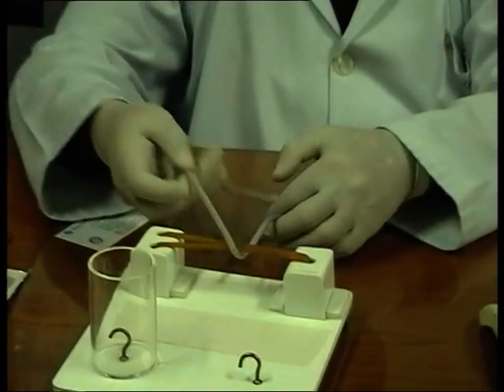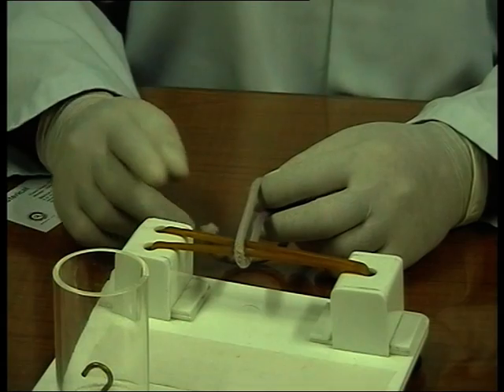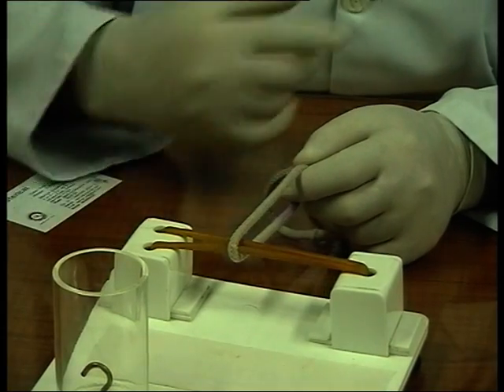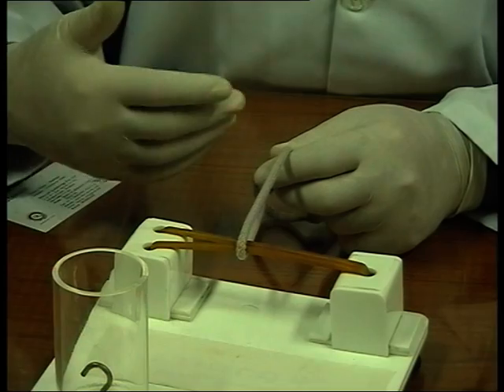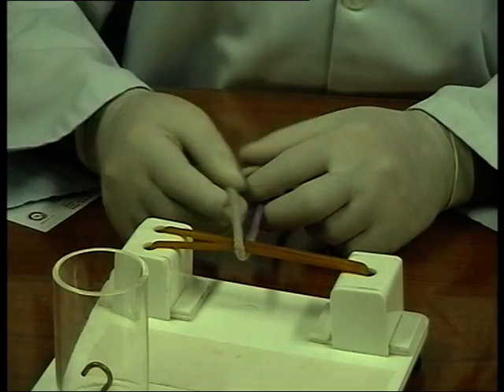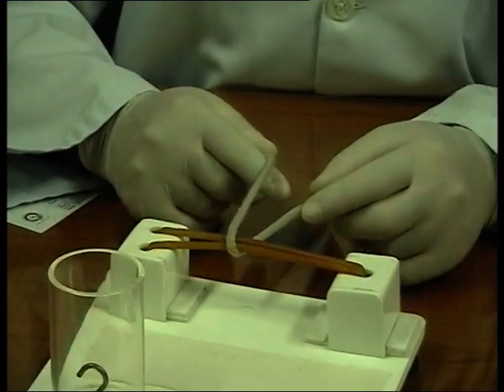Okay. Just to show you what a granny knot is besides this one, so that you don't use it. A very commonly used granny knot. And I told you that initially when starting that course we gave a surveillance assessment form to all the people who did it. Most people who participated were faculty. 60% of people were using granny knots. It's a pretty high percentage.